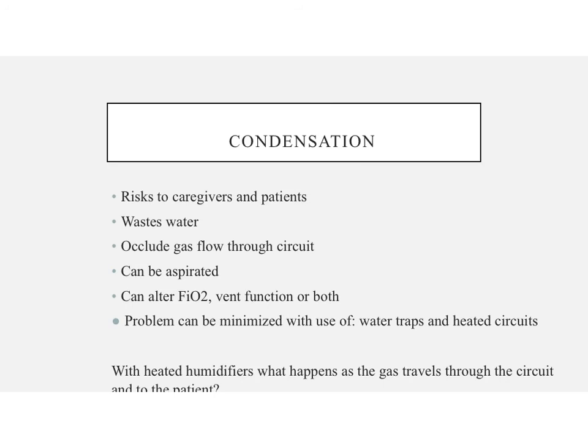If you have a heated circuit, do you need a drain bag? No, you wouldn't need a drain bag because that gas's temperature is being maintained all the way through the circuit.